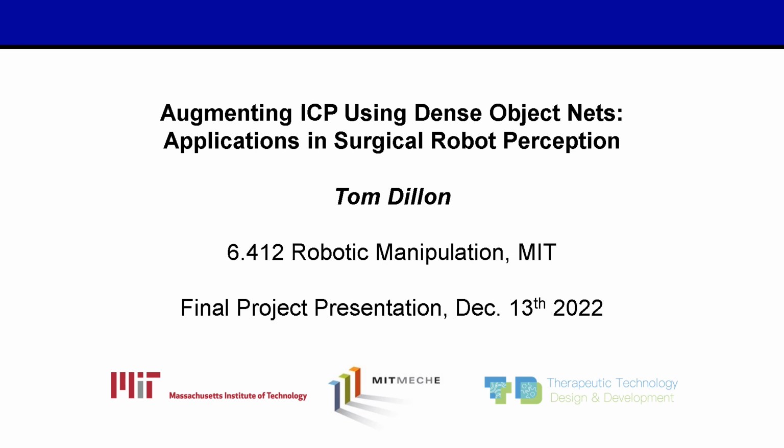Hi, my name's Tom, and today I'm excited to present my final project for robotic manipulation on augmenting ICP using dense object nets with applications in surgical robot perception.